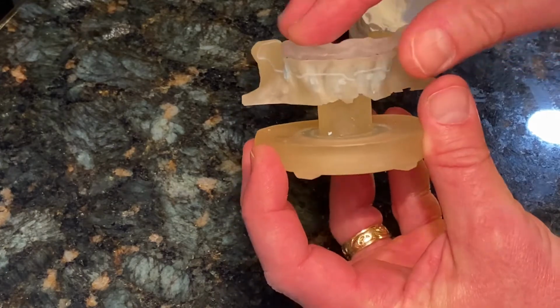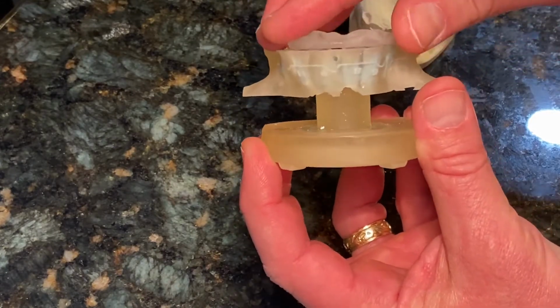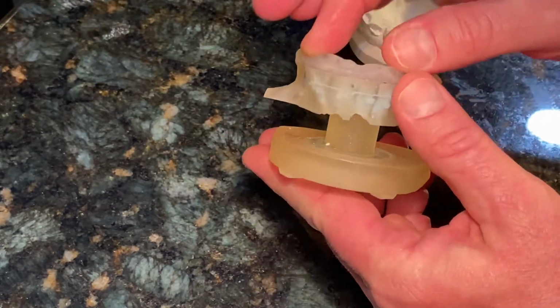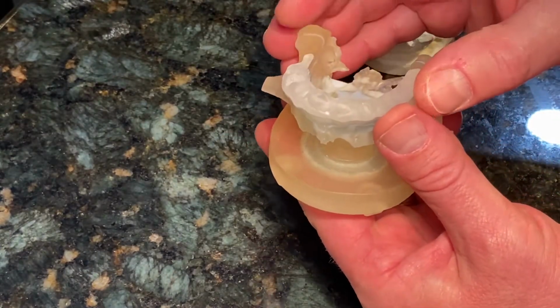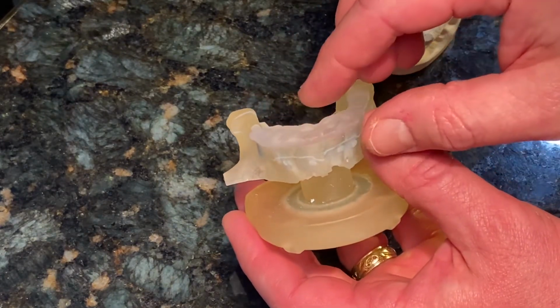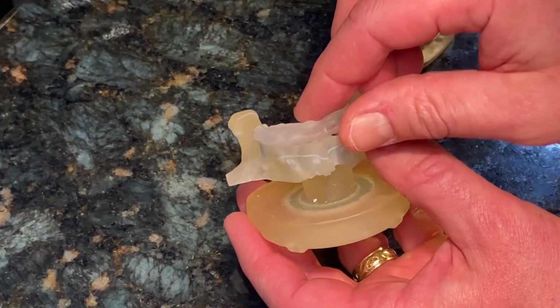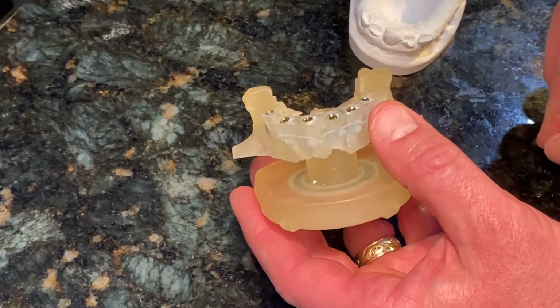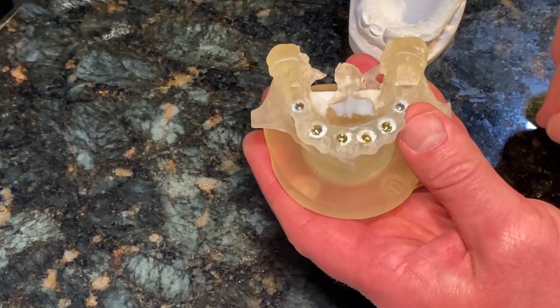Now, this is the actual model of the bone that we have to work with. After some of the superficial and weaker bone is out of the way, we can see exactly what we have and where the best bone is.